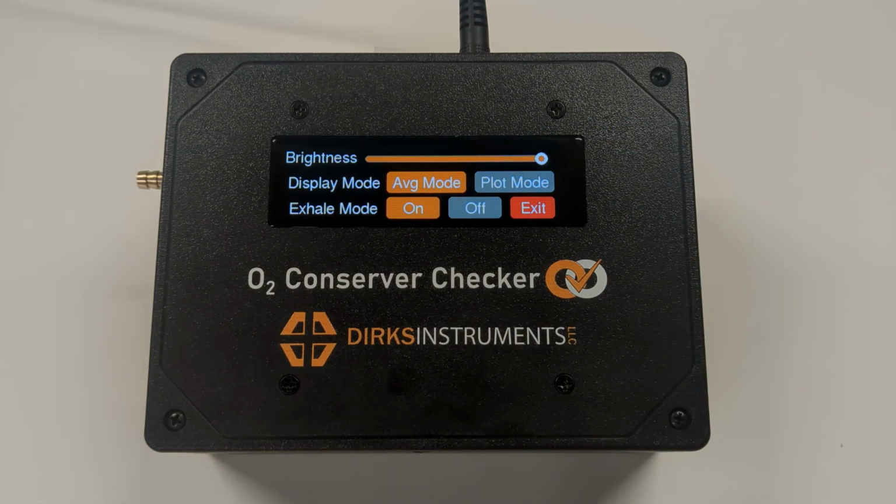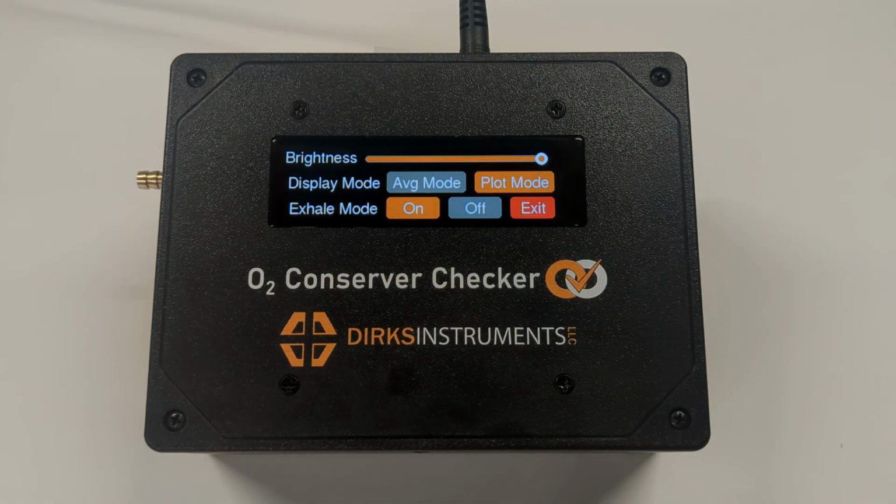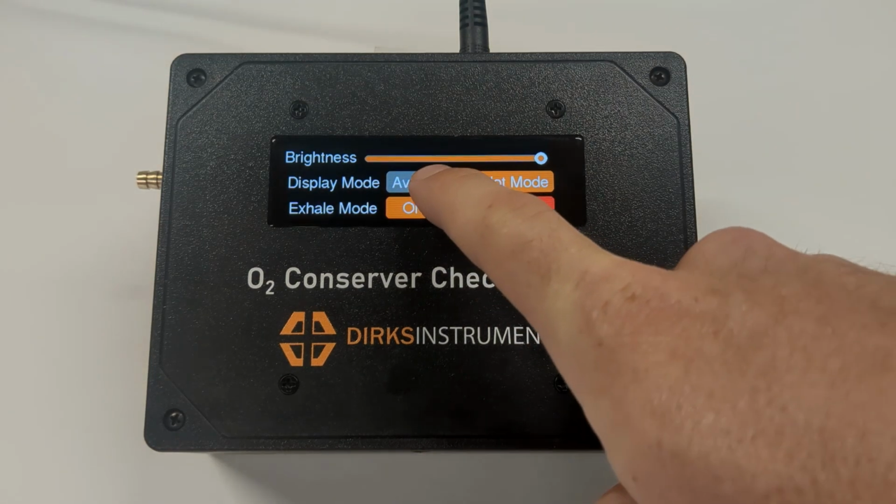This is the mode that we can change if we want to display the average values or if we want to plot the pulse waveform for a device. In plot mode, the average values are replaced by a graph showing the pulse waveform.